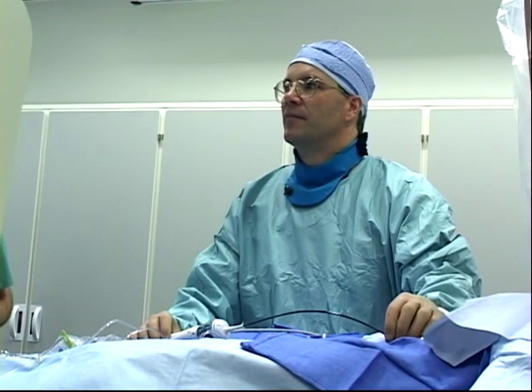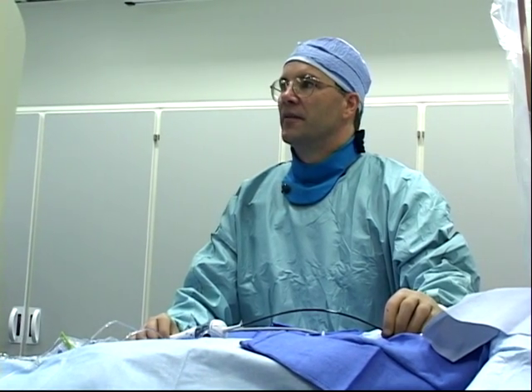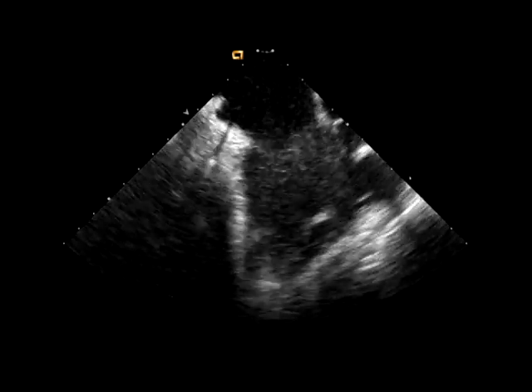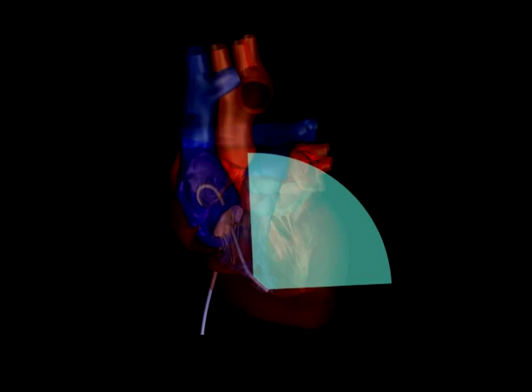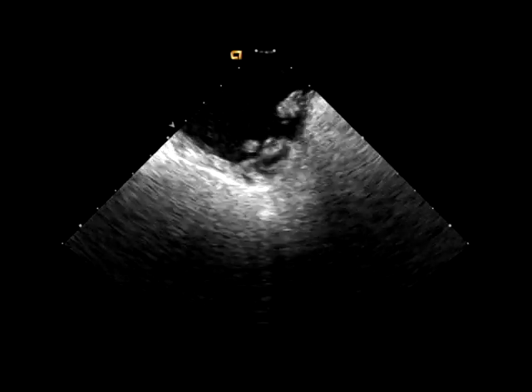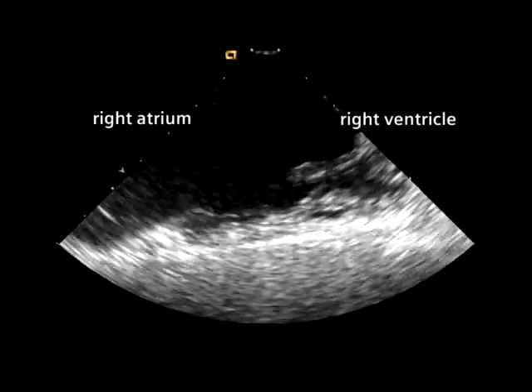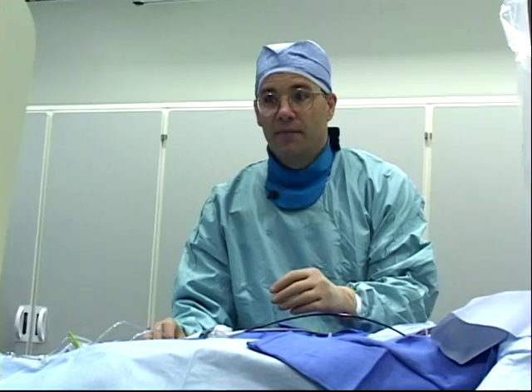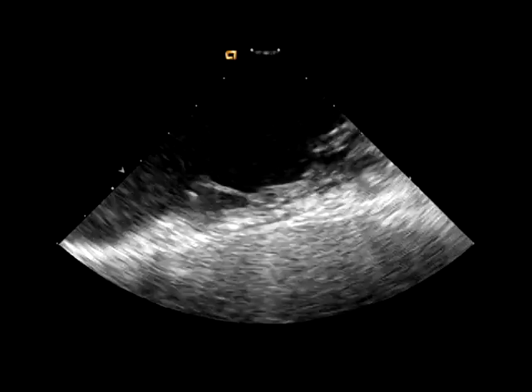We'll enter the right ventricle with the catheter in order to maximize image of the left ventricle. The way that this is done, starting from this image, is anterior flexion of the catheter, kind of with the image of bowing through the tricuspid valve, and positioning the catheter within the right ventricle. As soon as the valve is negotiated, the catheter is returned to a neutral position to keep from making a circle through the right ventricle. Fluoroscopy is also helpful in negotiating this, but it can be done entirely on echo guidance as well.